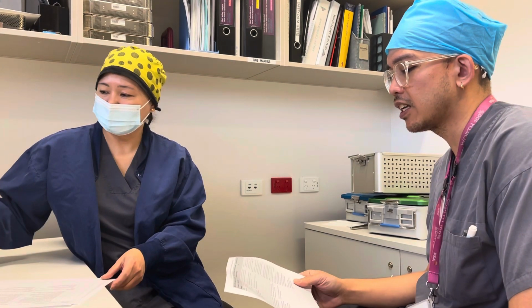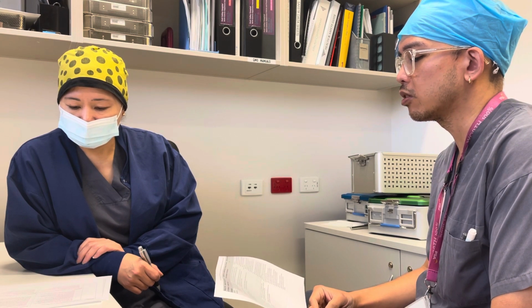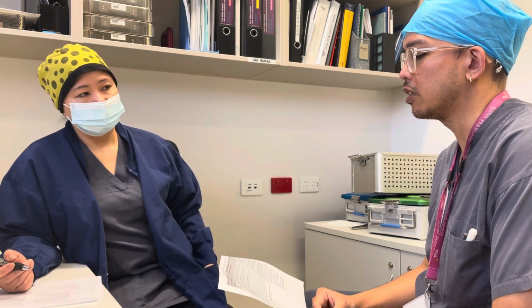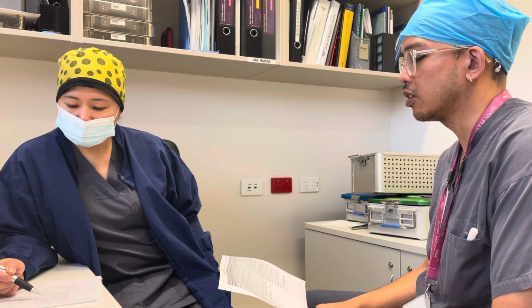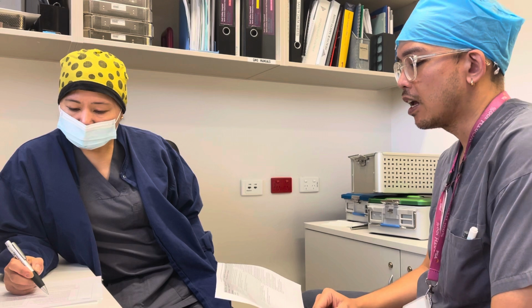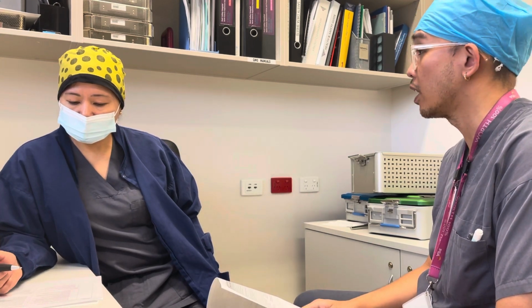Moving on to ASNZS 4815 2006, the scope of it is similar to 4187 in regards to most RMDs, but instead only covers office-based healthcare facilities involved in non-complex patient procedures and sterilization processes. It encompasses the environmental conditions for sterility maintenance of both in-house produced and commercially supplied sterile items. It can also be applicable to sterile departments that process RMDs on behalf of such office-based smaller organizations.